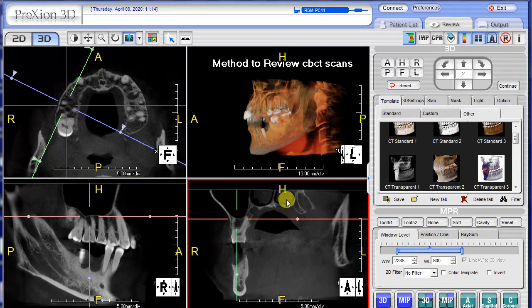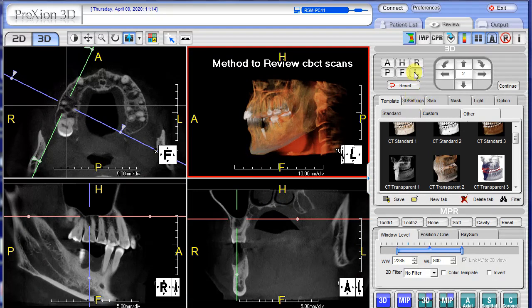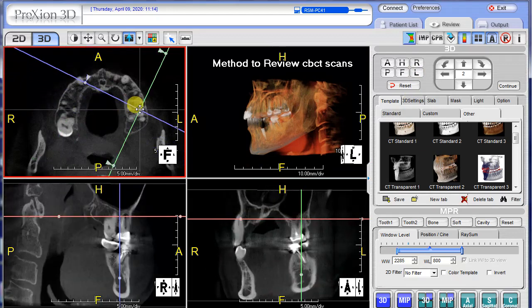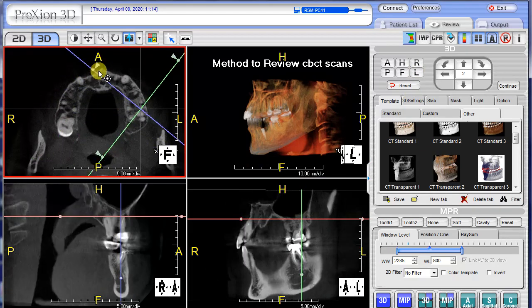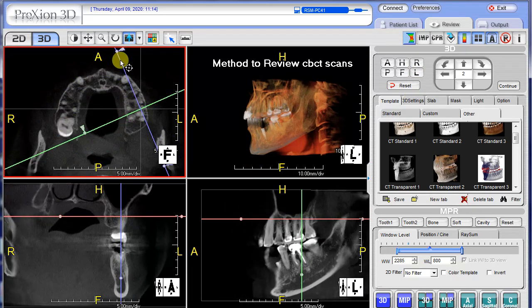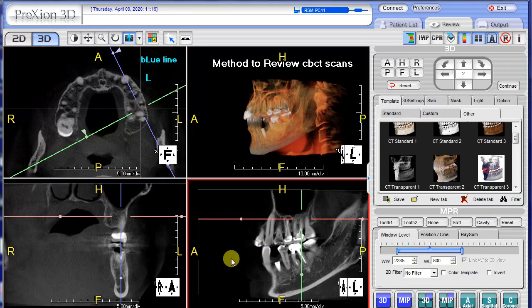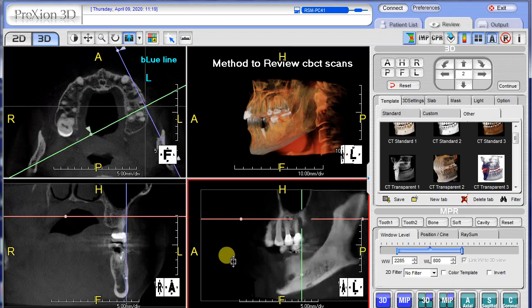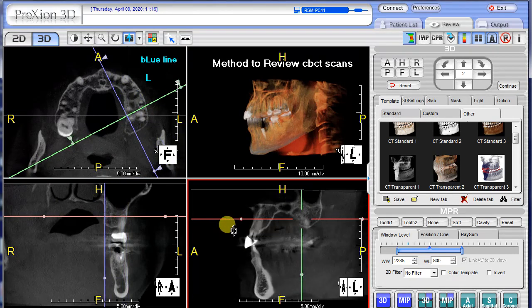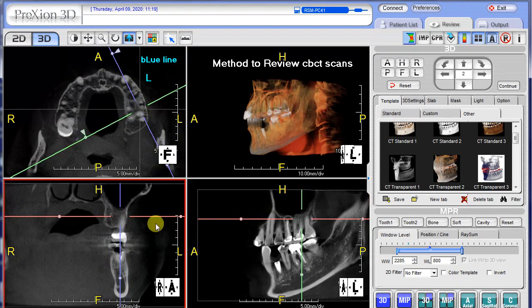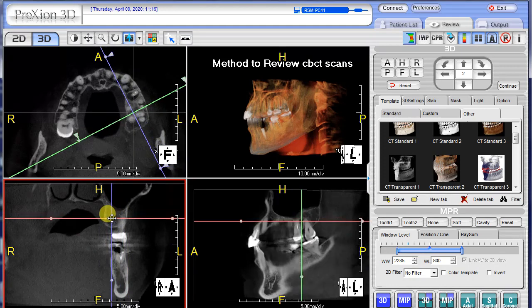To evaluate the left side, you may hit the reset button or drag with the target zone and drag over to the other location. This time align the blue line to the left side — remember blue for left. Here you can scroll in sagittal, moving buccal to palatal, or you can grab the line and do the same thing on this screen for evaluation.